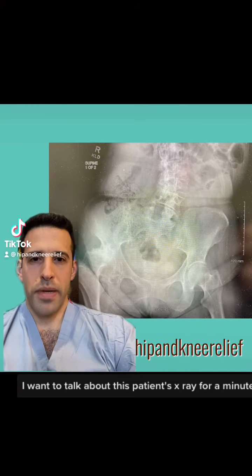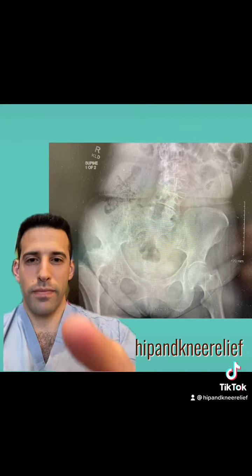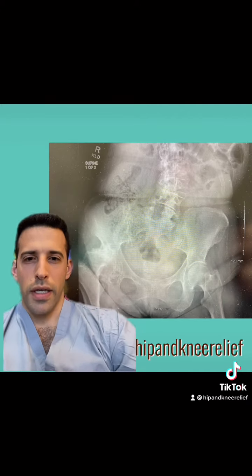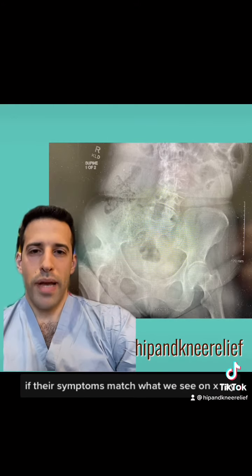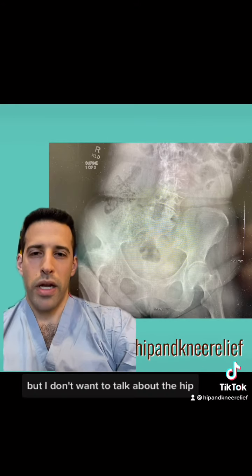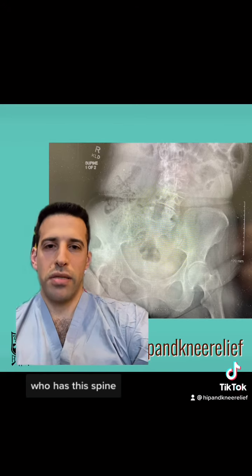I want to talk about this patient's x-ray for a minute because they have a severely arthritic right hip, as we can see here, and they're definitely a total hip replacement candidate if their symptoms match what we see on x-ray. But I don't want to talk about the hip, I want to talk about what you need to think about when you see a patient who has this spine.